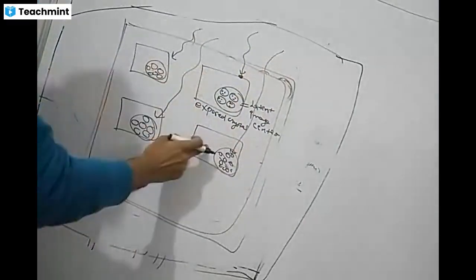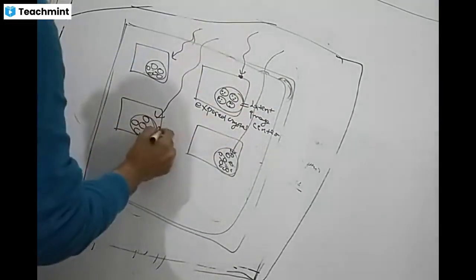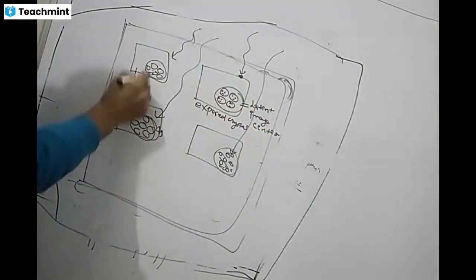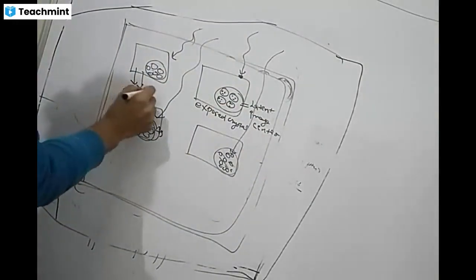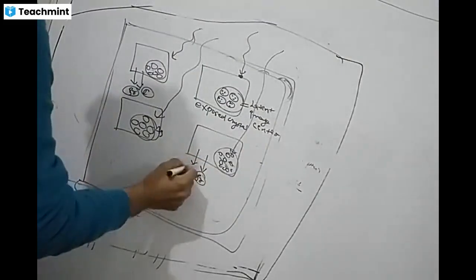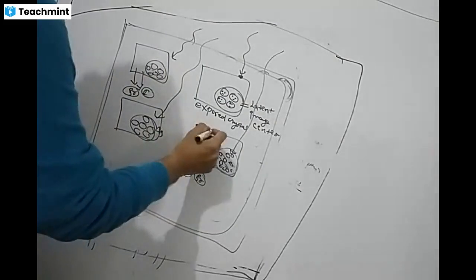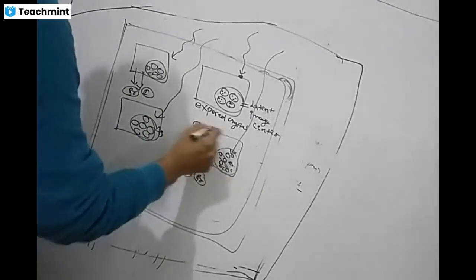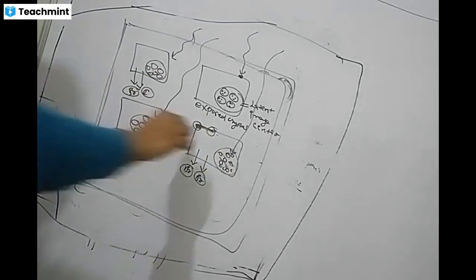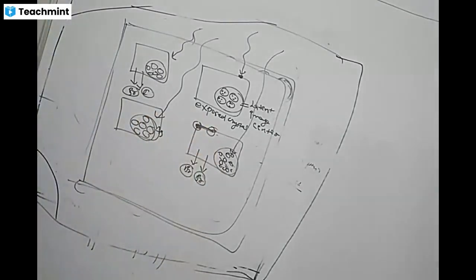So in these crystals, silver ion is reduced to metallic silver, and in these crystals, what comes out into the gelatin? Your bromine or iodine, the halide, will come into the gelatin. Why does it come out? Because this is an ionic crystal. Two ions are connected by positive and negative charges. If you remove the charge of one, it will become neutral and will come out of the crystal.